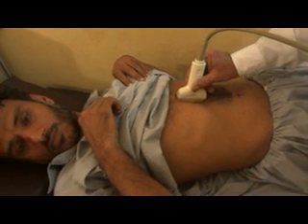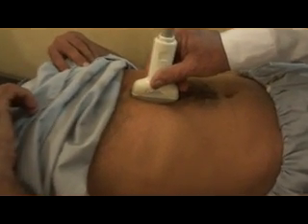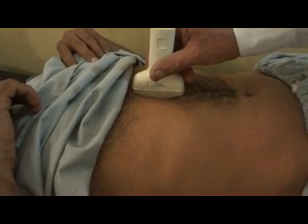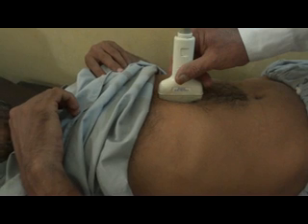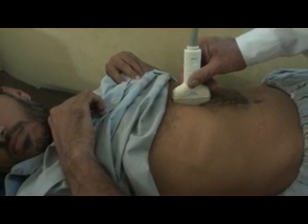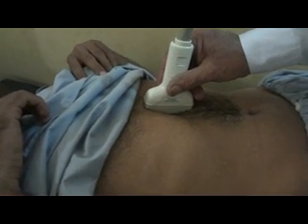This is the splenic vein, and you see this structure, this is the vein. This is the superior mesenteric vein, so it becomes continuous with the superior mesenteric vein. Then it joins the portal vein and becomes the portosplenic confluence.